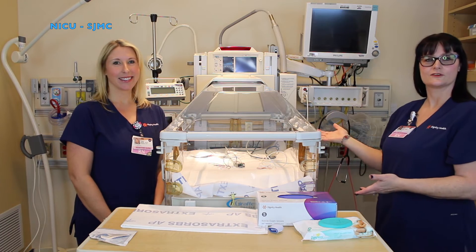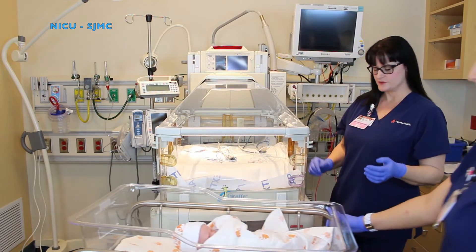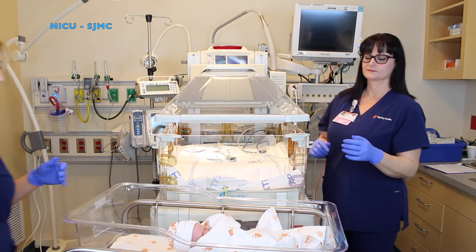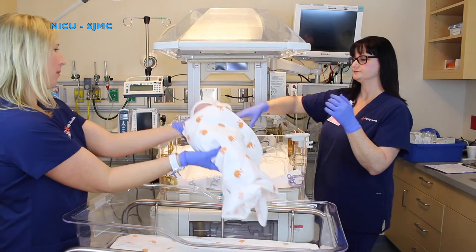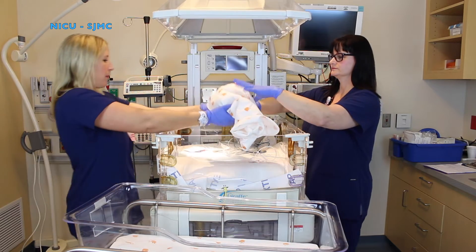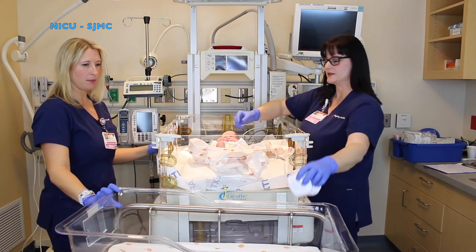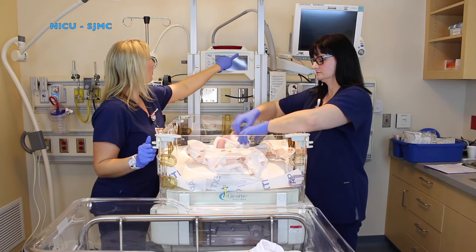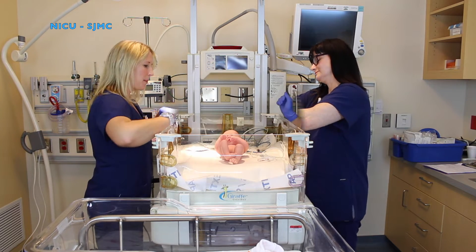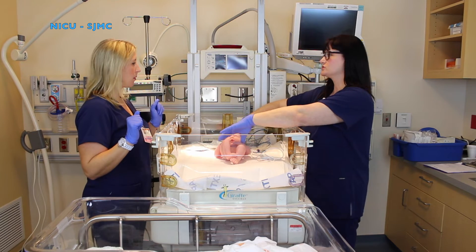Now your giraffe bed is ready for your admission. Once your patient arrives in the unit for admission, you're going to want to place your baby on your giraffe. You're going to undress your baby. Once your baby is undressed, it's going to be ready to be weighed and measured.